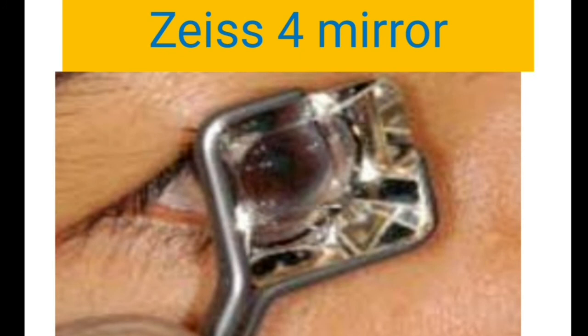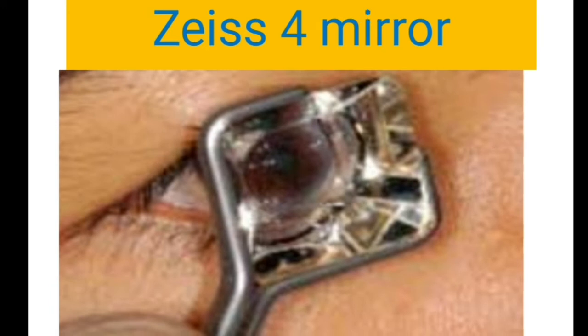Suppose you are finding it difficult to visualize some quadrants, especially the nasal quadrant, which is a little difficult to visualize, then you can do some manipulations like asking the patient to look in the direction of the mirror. Then the angle structures will be a little more easily seen.